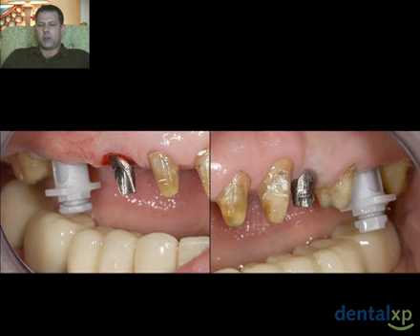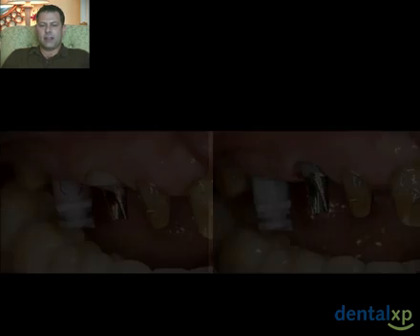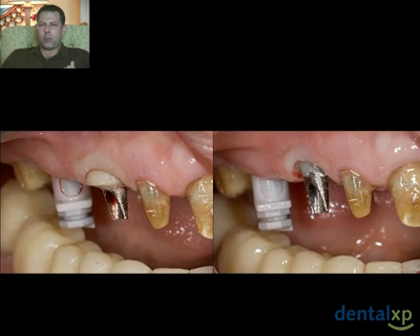So the first thing we do is put our temporary abutments in, prep them a little bit so they draw, and now refine the soft tissue height by adding or subtracting from the bulk of that temporary abutment. So again, we go through this process, adding composite to that temporary abutment. After placing it in the mouth, we then prepare it in the mouth with the soft tissue in the ideal position, and now we're able to put the soft tissue margin at the same level as our temporary abutment so that our cement line is more coronal relative to the head of the implant.